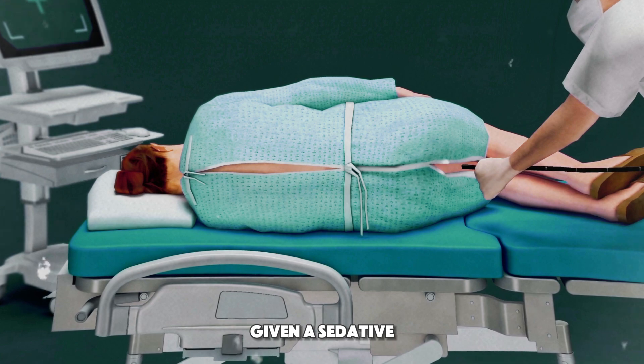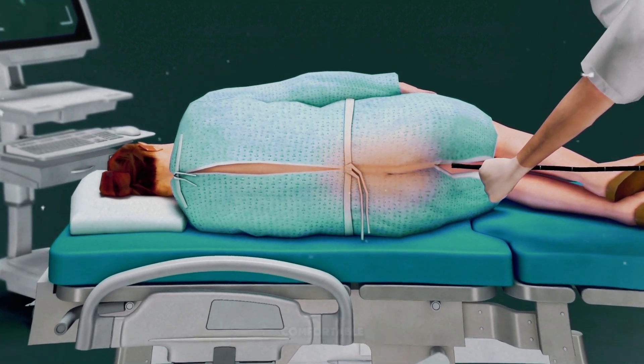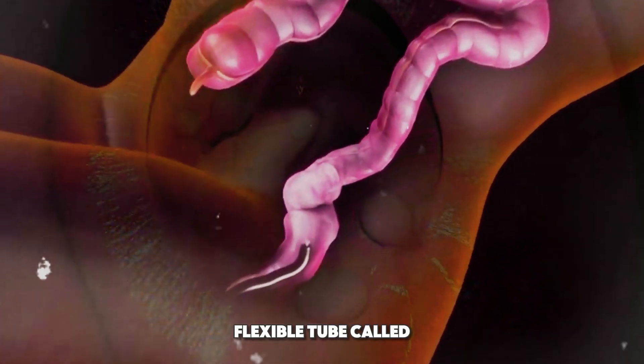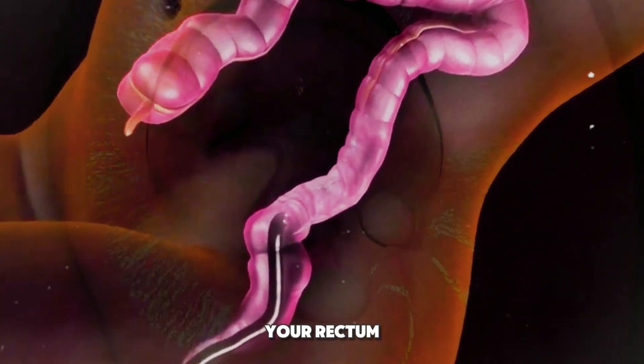First, you'll be given a sedative to help you relax and stay comfortable. Then, the doctor gently inserts a thin, flexible tube called a colonoscope into your rectum.